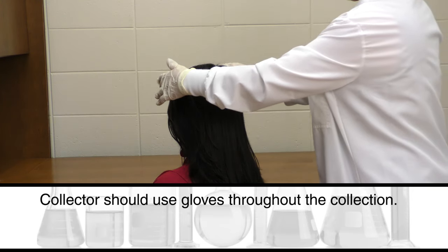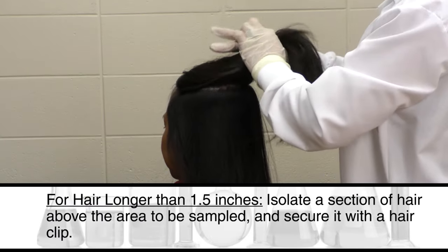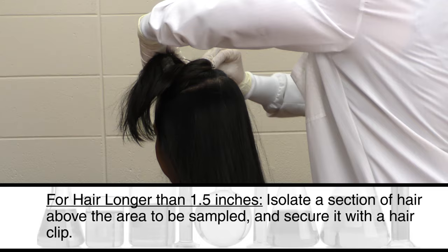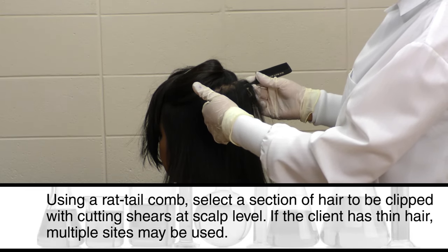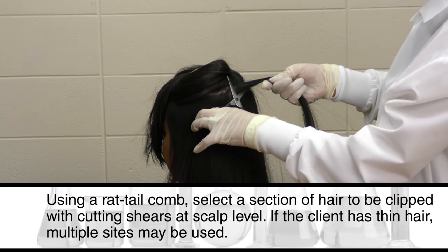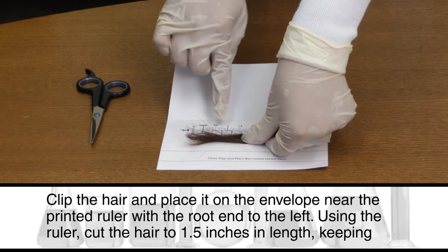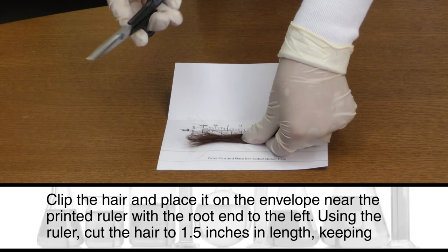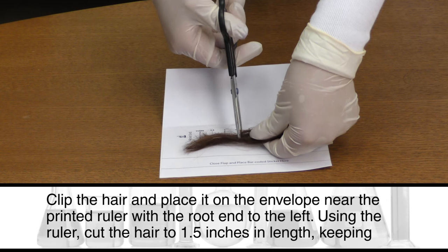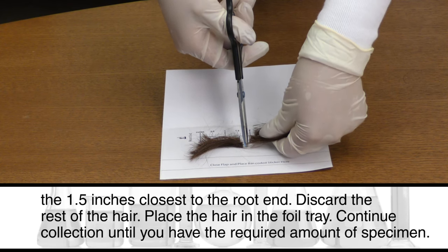Collectors should use gloves throughout the collection. For hair longer than 1½ inches, isolate a section of hair above the area to be sampled and secure it with a hair clip. Using a rat tail comb, select a section of hair to be clipped with cutting shears at scalp level. If the client has thin hair, multiple sites may be used. Clip the hair and place it on the envelope near the printed ruler with the root end to the left. Using the ruler, cut the hair to 1½ inches in length, keeping the 1½ inches closest to the root end. Discard the rest of the hair and place the hair in the foil tray. Continue collection until you have the required amount of specimen.